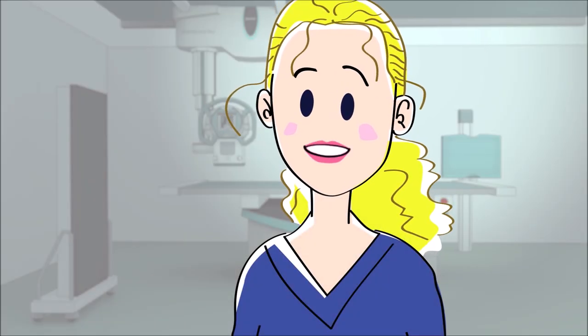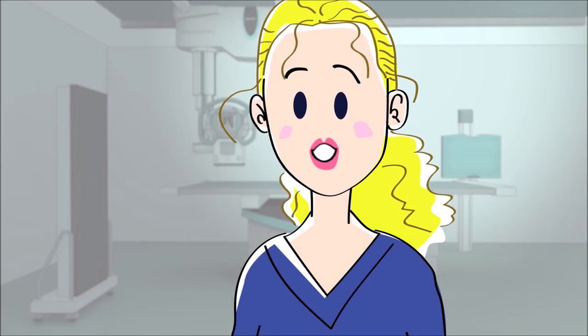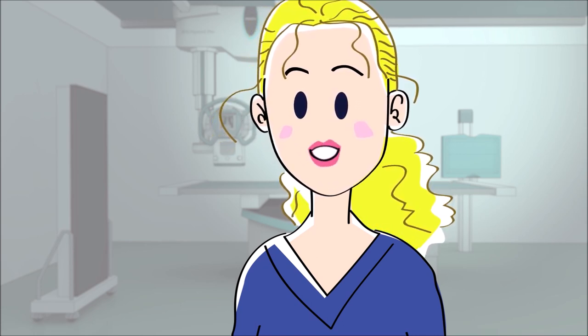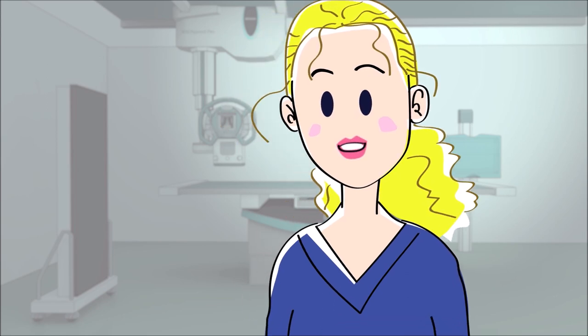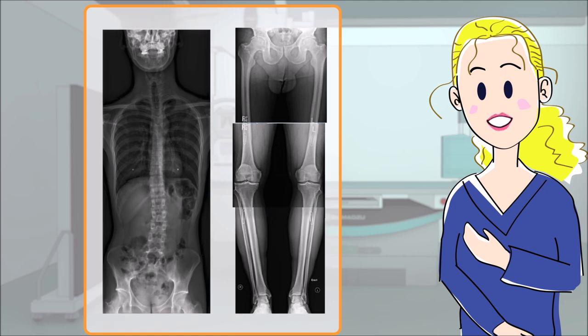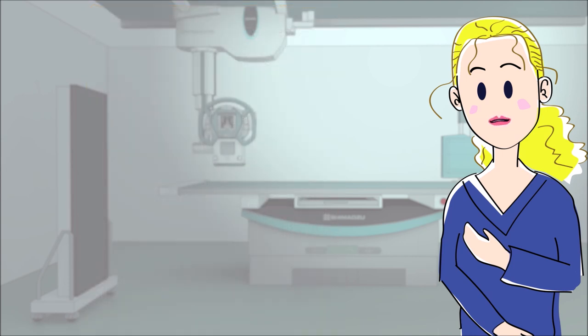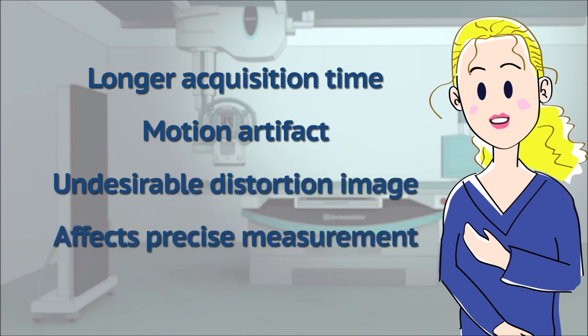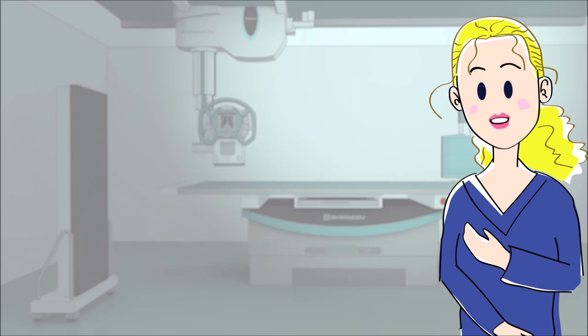Nowadays, long-view radiography is used for most spinal diseases that cause spinal deformity, as well as for post-operative assessment and pre-operative planning for joint replacement in the lower extremities. To capture long-view images, such as the whole spine or whole legs, it is necessary for the X-ray machine to take multiple images that later get stitched together. This requires longer acquisition time and can cause patient motion artifact. Also, image distortion is not desirable because it affects precise measurement in surgery planning.